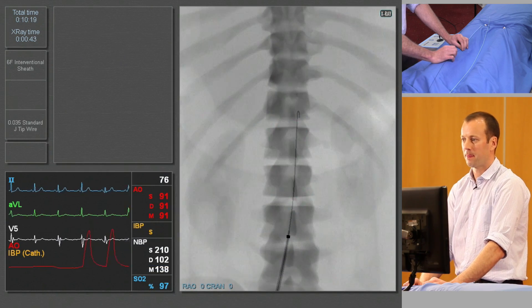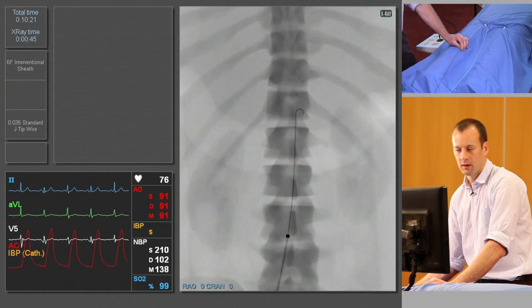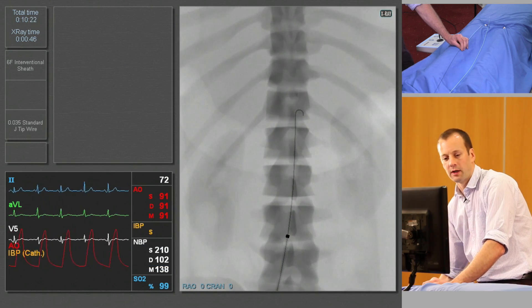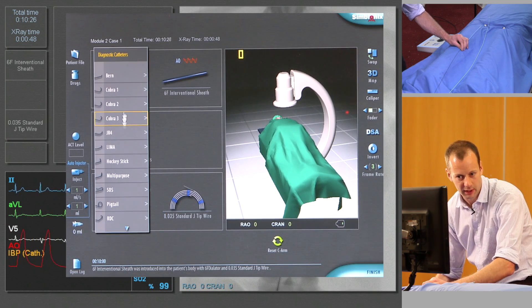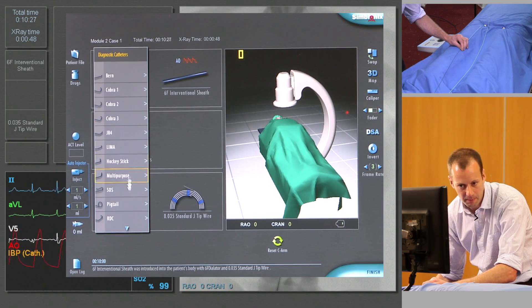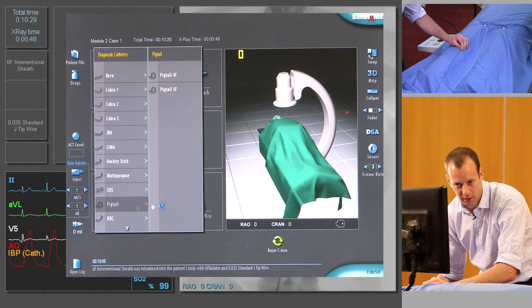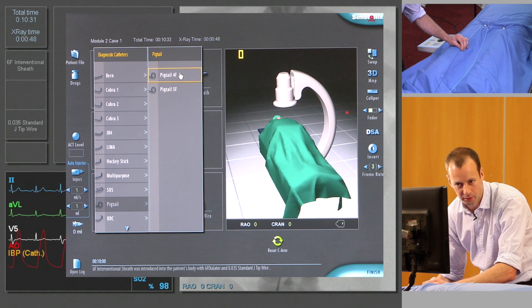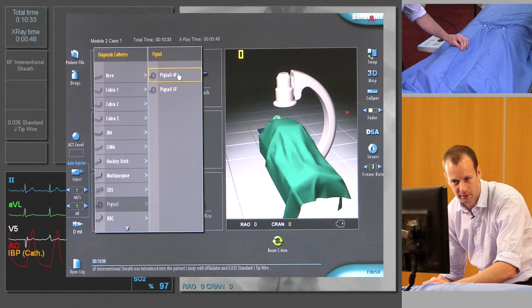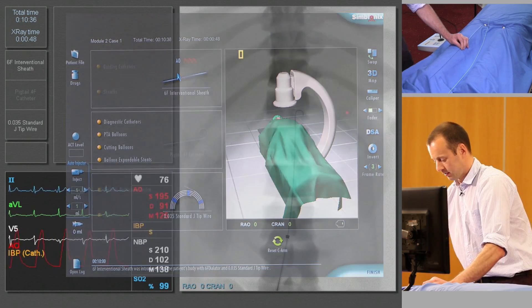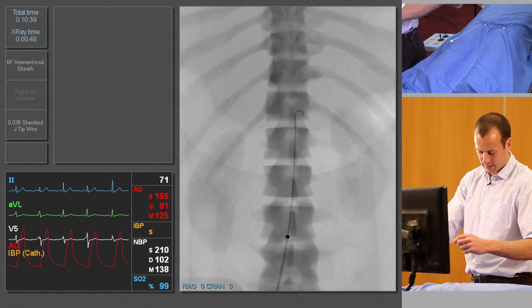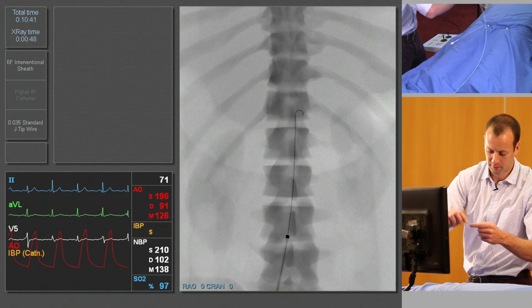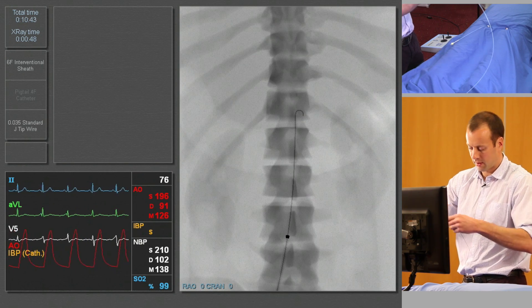You'll see it disappear there. We're then going to insert a pigtail catheter to allow us to do an aortic angiogram to give us some idea where the renal arteries are. It doesn't much matter whether it's a four or five French pigtail in this case. Leaving the tip of the wire and the sheath in the same place, we'll advance the catheter over the wire.